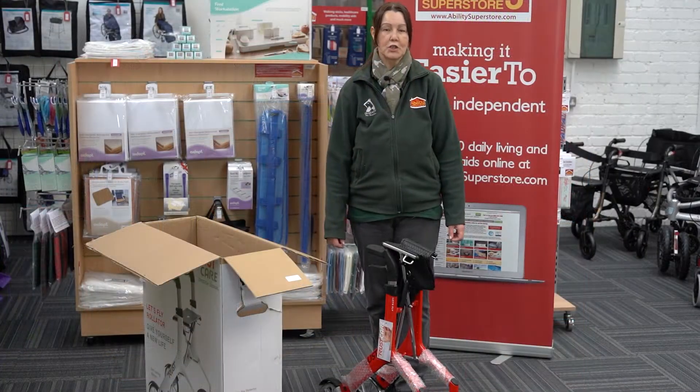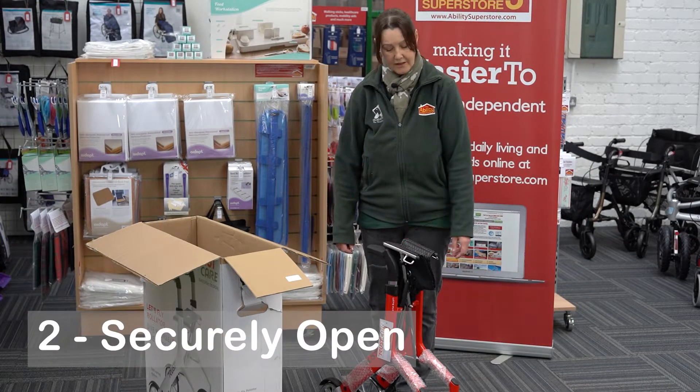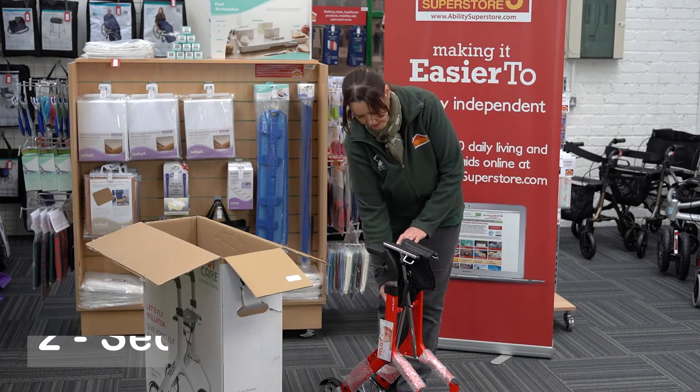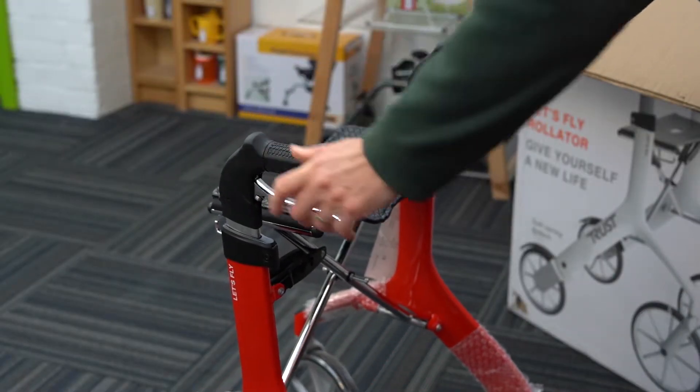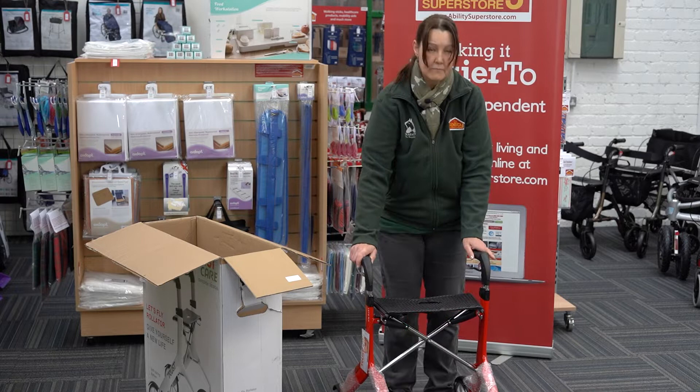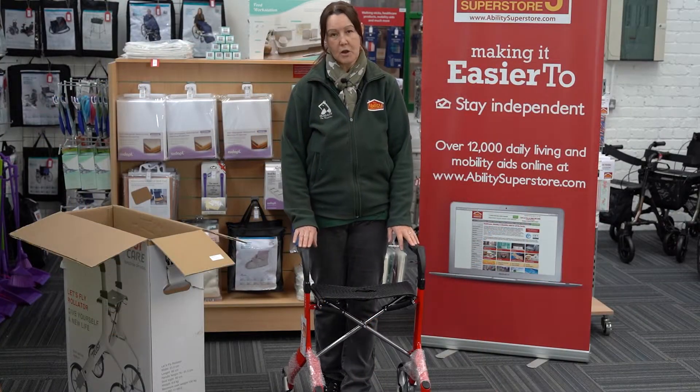The first thing you'll notice when you take it out of the box is it's very lightweight. To open it, there's a catch under here - simply pull it up, spread it out like that, and hear it click. Once it clicks, it's ready.